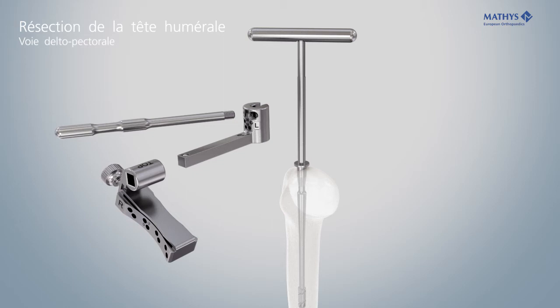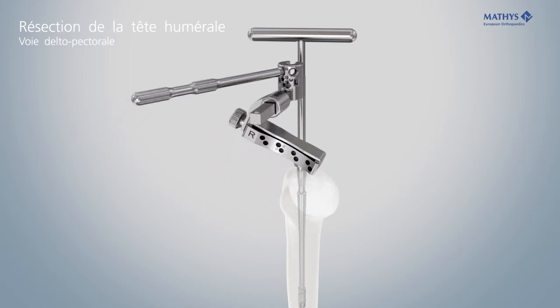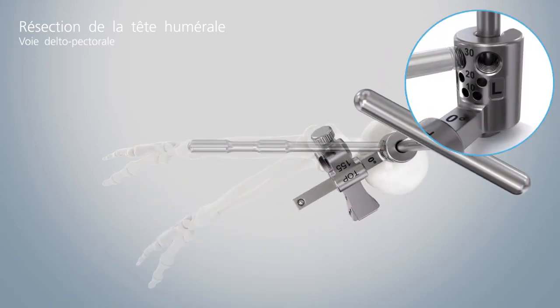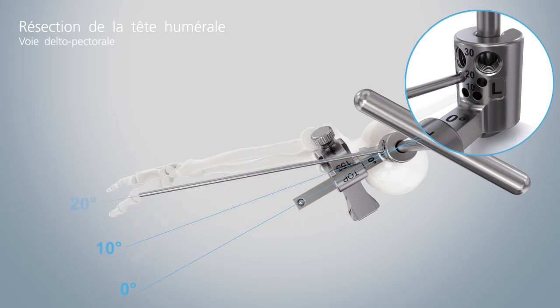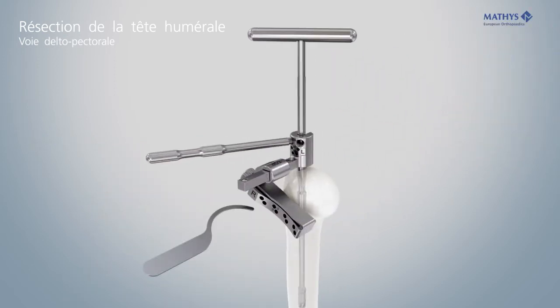Assemble the resection guide for the right or left side. Use the glider resection guide angled by 155 degrees. Set the desired retroversion by aligning the alignment rod or the Kirschner wire on the forearm. Use the stylus to fine-tune the retrotorsion and resection height according to the anatomical conditions.